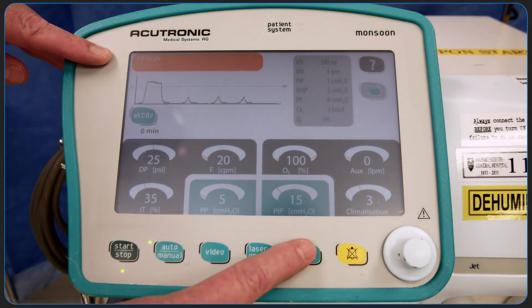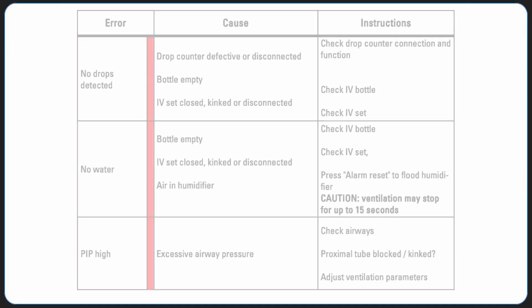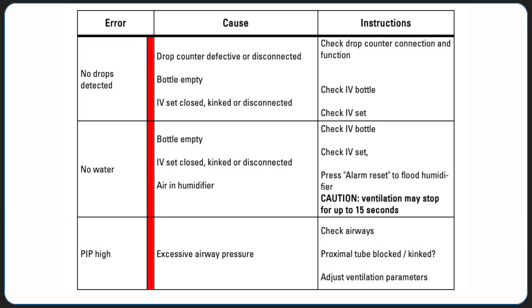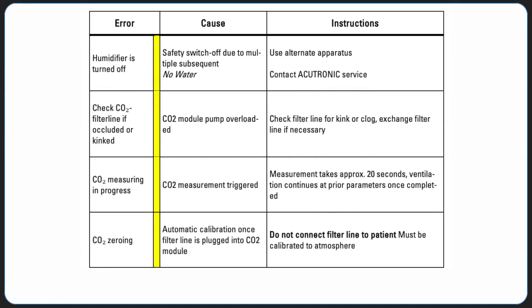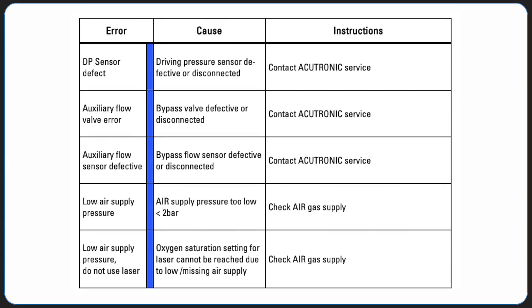Alarm messages stack on top of each other on the upper left corner of the screen. Red alarm messages are related to the patient. Yellow alarm messages are informational. And blue alarm messages are related to the system.